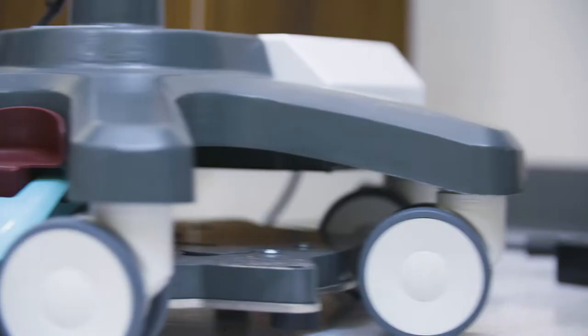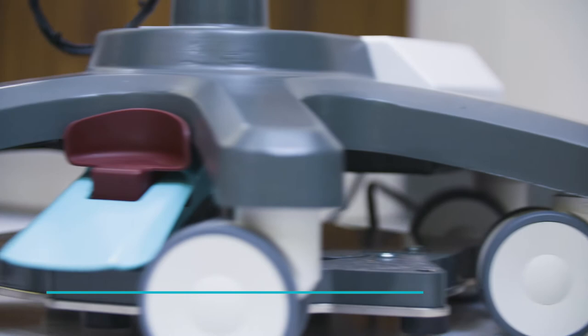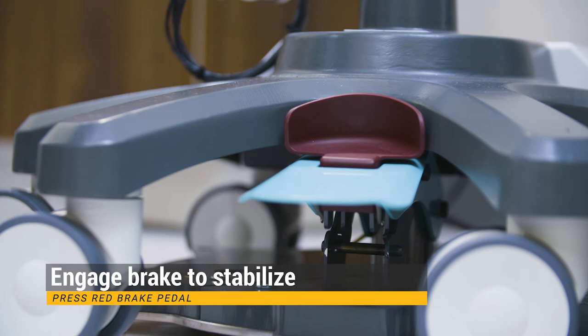Once in the proper position, press the red brake pedal to engage the foot brake so it is stable during the exam. To avoid injury, never use your hands to operate the foot pedal.